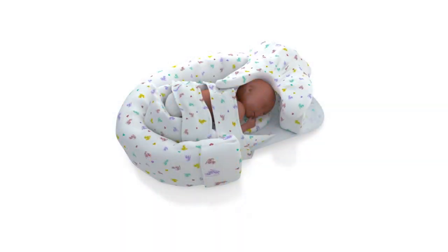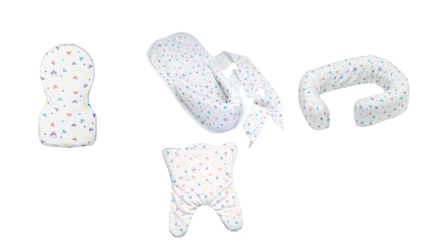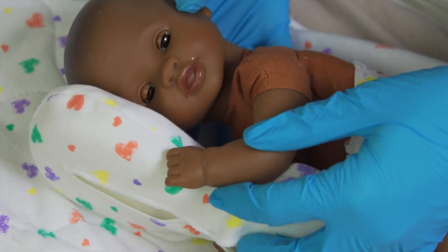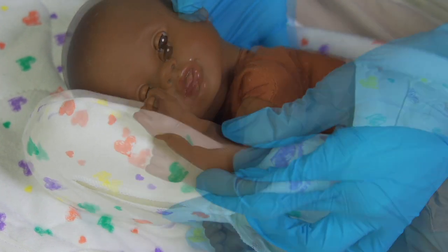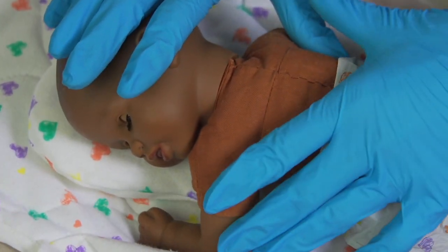Prone positioning provides support that assists in maintaining flexion of the hips and shoulders, similar to what the infant experiences in the womb. Select a Prone Plus, Snuggle Up, and Bendy Bumper in the appropriate size for this position. Add a Frederick T. Frog as appropriate. Position the Prone Plus from above the umbilicus to the head, no wider than the infant's nipple line. Hold and slowly rotate the infant to a prone midline position.